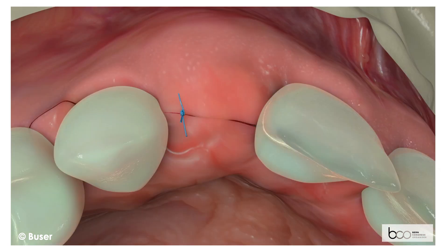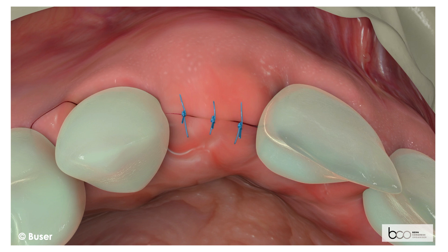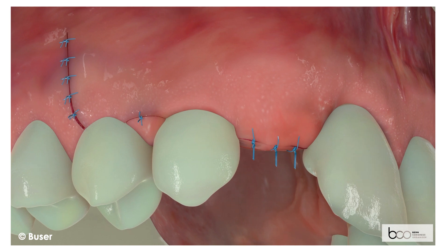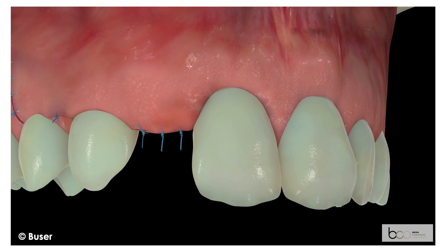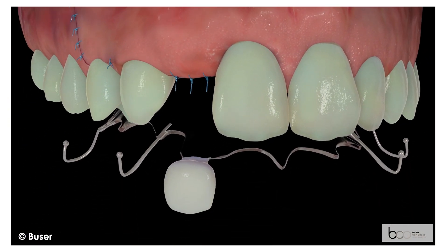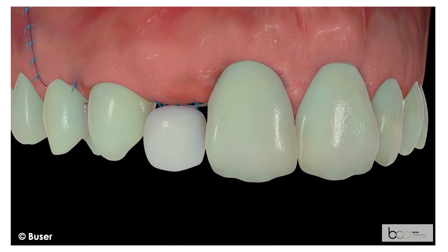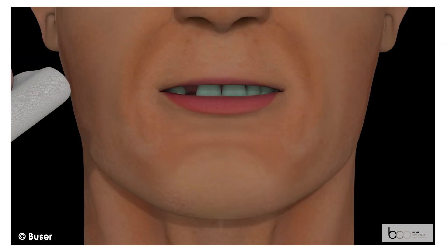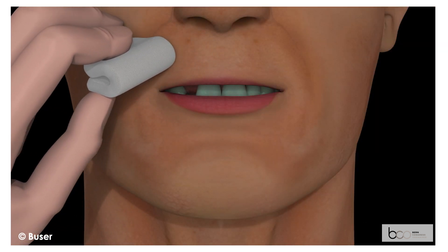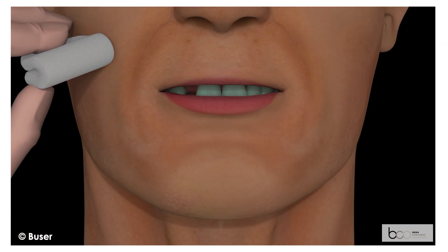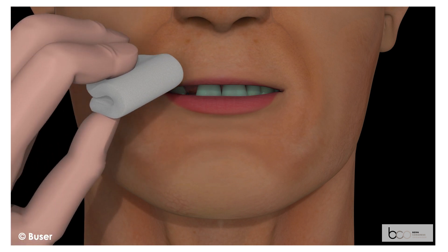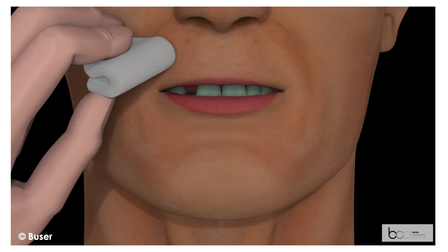Several sutures are applied to achieve close adaptation of the wound margins. This is followed by insertion of the provisional prosthesis, which has been shortened in the edentulous area to avoid direct tissue contact. A pressure dressing is applied to the upper lip to minimize post-surgical swelling in the first two days of healing.